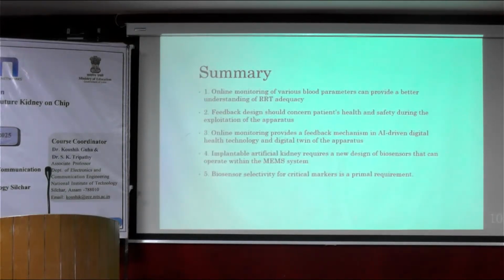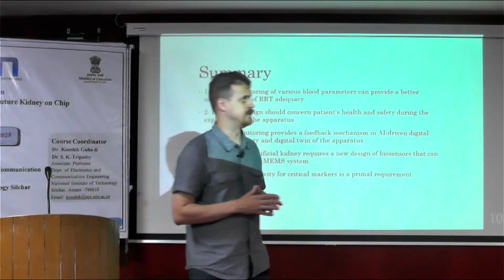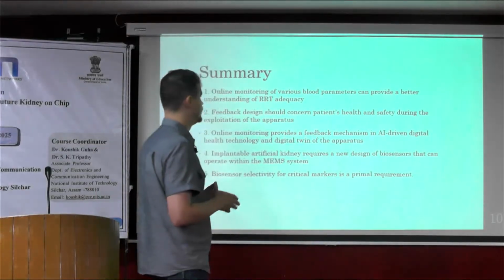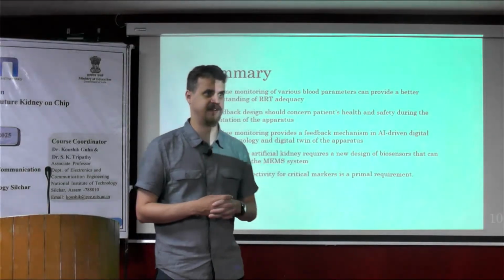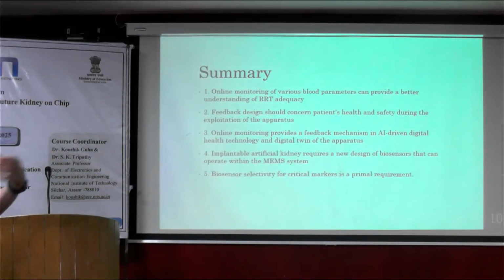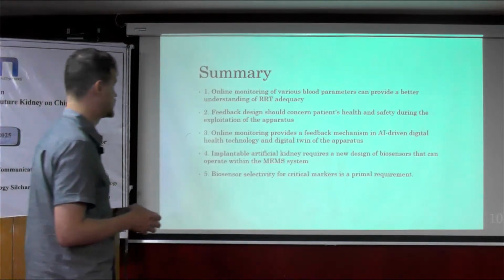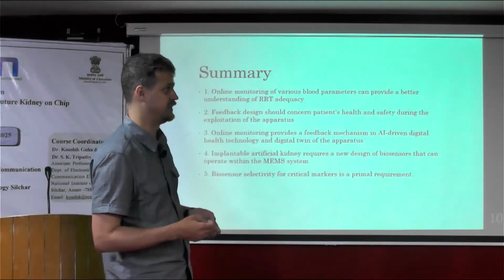Just to bring a quick summary of my lecture 9: in order to evaluate the adequacy of renal replacement therapy in terms of an implantable artificial kidney, we need to provide online monitoring of the basic blood parameters.